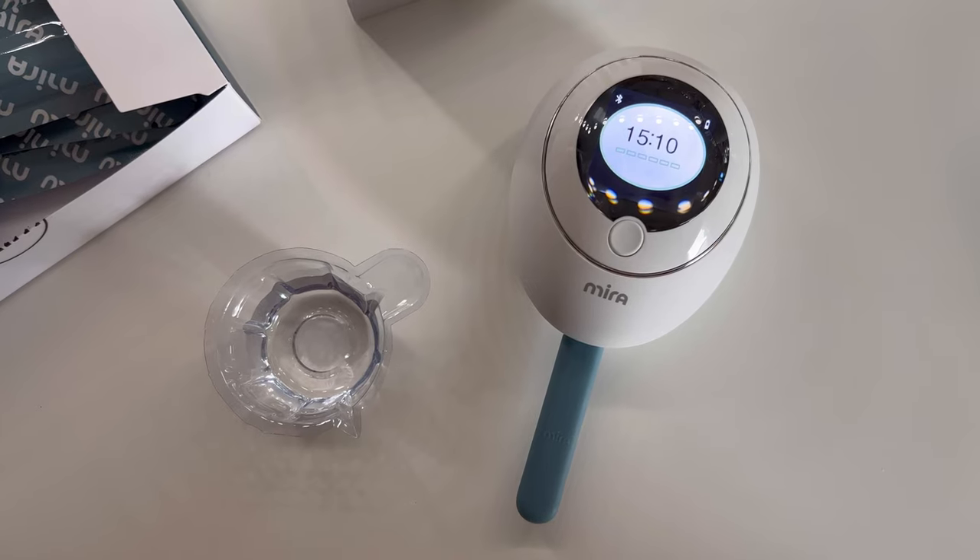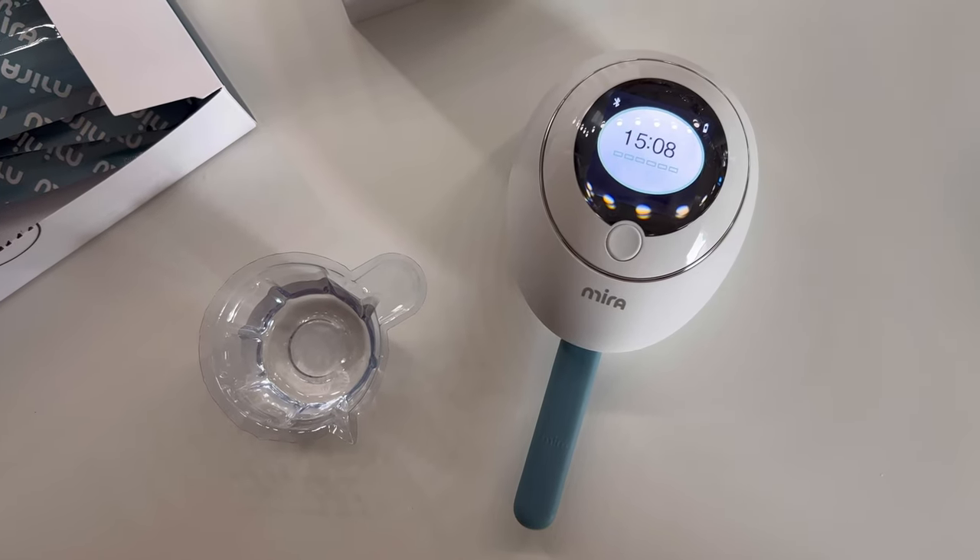Once it's done, it will automatically send the data to your Mirror app. The app also offers you a larger fertility window of six days with clear insights. So no matter if you're trying to conceive or avoid pregnancy, Mirror Fertility is able to find your fully fertile windows or your infertile windows.